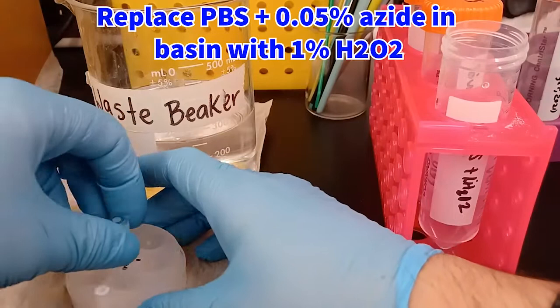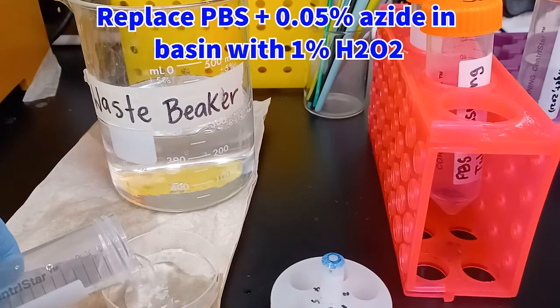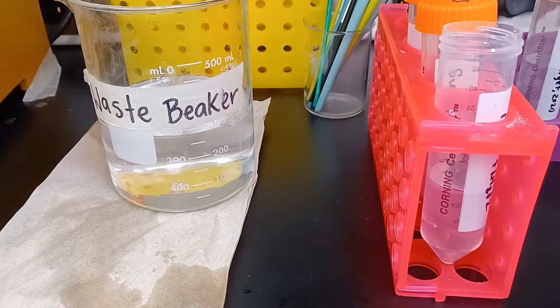Retrieve your netwell from the shaker. Take out the netted insert, rest it on a smooth surface, discard the solution in the basin into your waste beaker, and replace it now with the 1% hydrogen peroxide solution and reinsert the netted insert. Put the netwell back onto the shaker and have it shake for 10 minutes in this diluted hydrogen peroxide solution. This is the second of the two endogenous peroxidase inactivating steps that is necessary to prevent background staining.